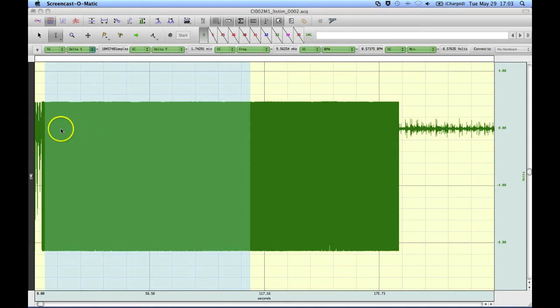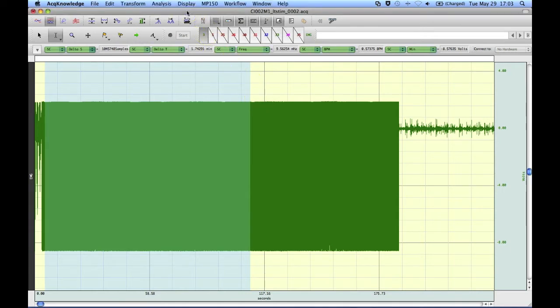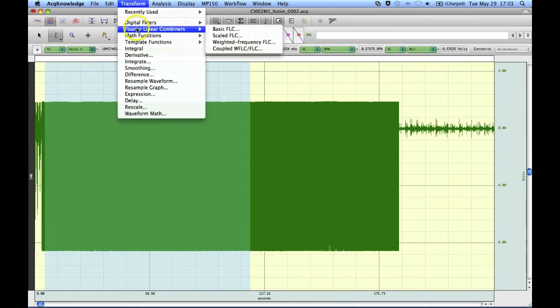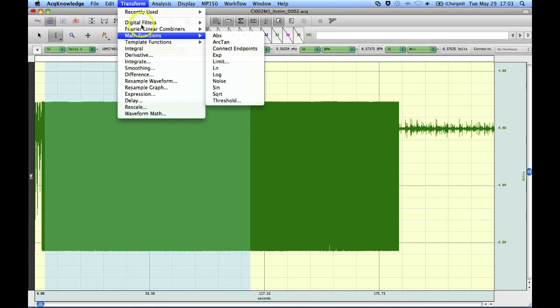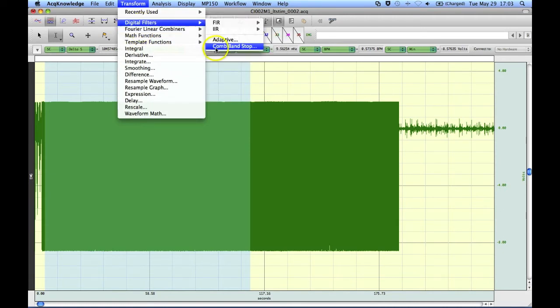But during the actual firing the signal was just swamped with the noise from the scanner. Now there's a very nice filter in Acknowledge that will allow us to remove a lot of this noise. But in order for that filter to work, the filter in question is the comb band stop filter.